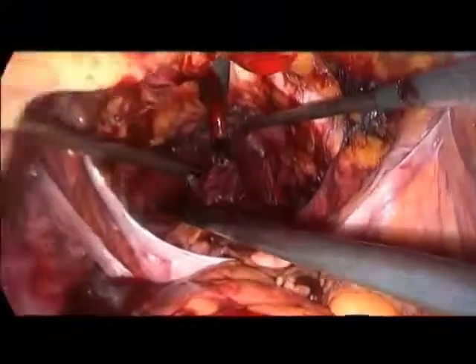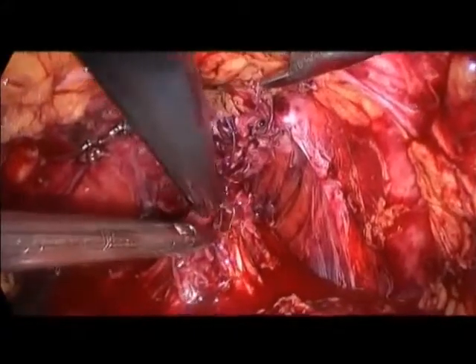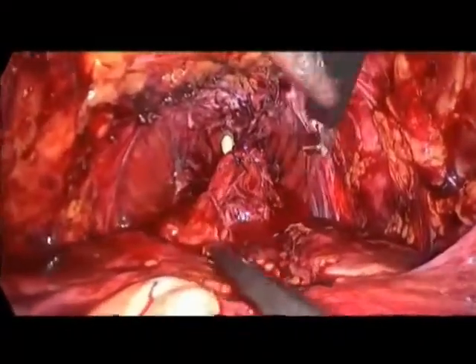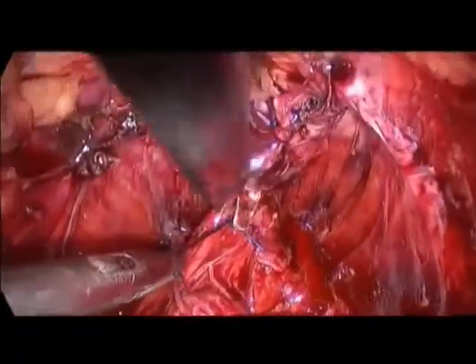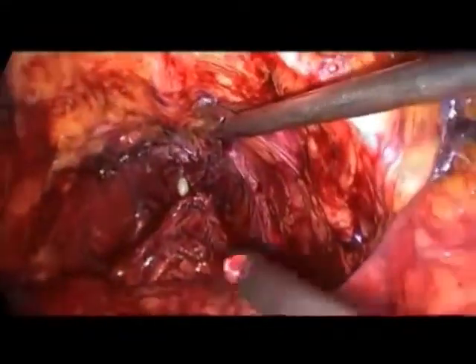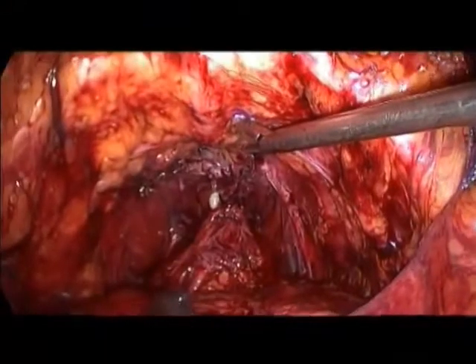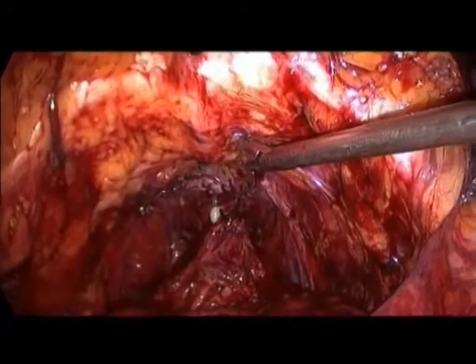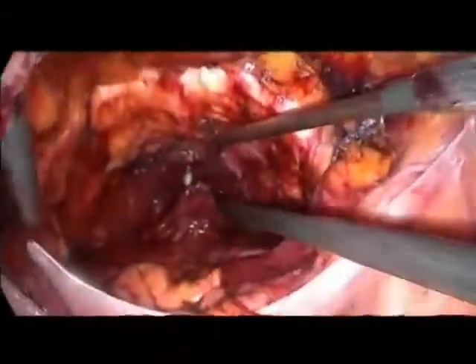Okay. Get in. I will play the hairdresser a little bit. Okay, this is one. And this is two. Okay, now I will take the stitch for the anastomosis. Also, make this a little shorter. Roland, I'm ready. I'm with you. We will now start the anastomosis.